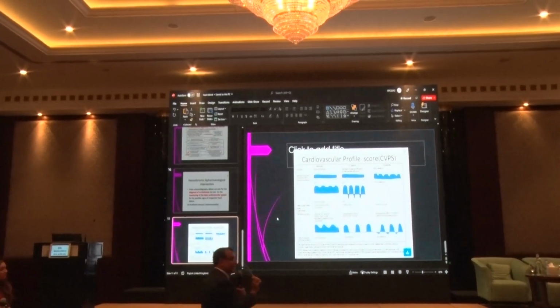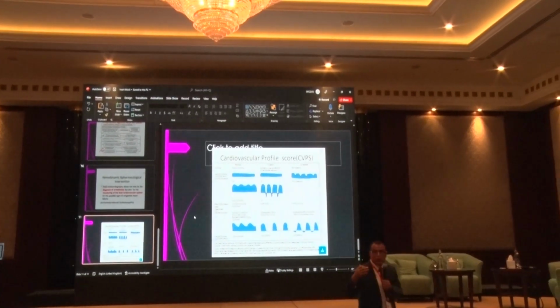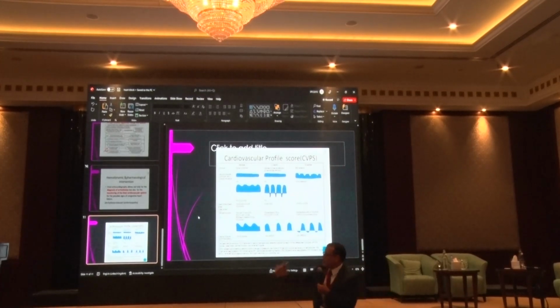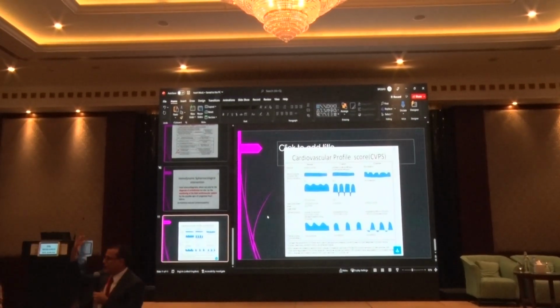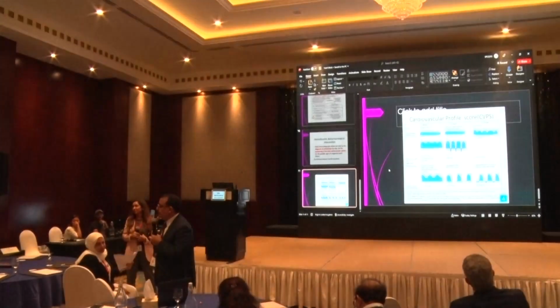The other thing, when you look at what we saw in the Doppler that Dr. Iram gave us, it doesn't necessarily give us an idea about the rhythm. The best way to assess the rhythm is to go where? To the heart itself. Okay, so how can we get the rhythm? Dr. Diana, how do you help us? So M mode, normally, if you can get a good view, or you can try to scan both atrium and ventricle, and we put the M mode on them. However, be careful when you do M mode for the atrium, the atrial pulsation, you're not going to appreciate it really nice and crispy.